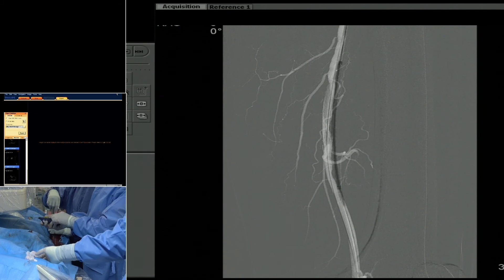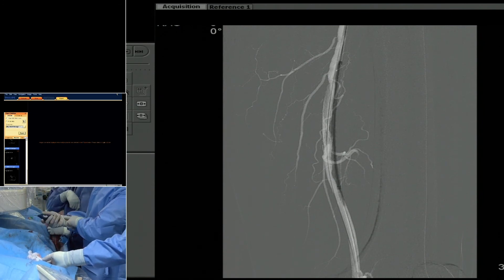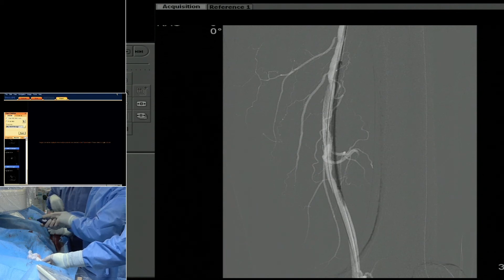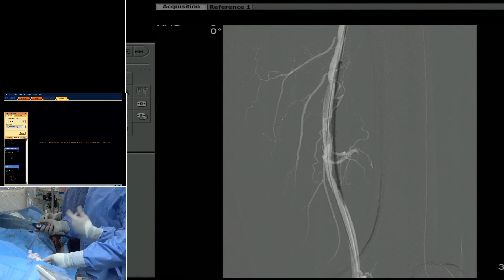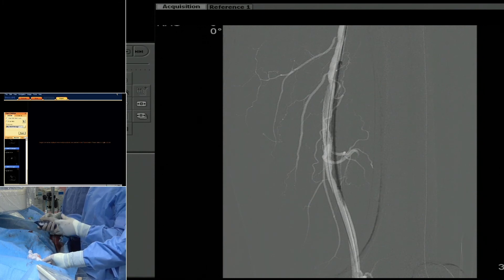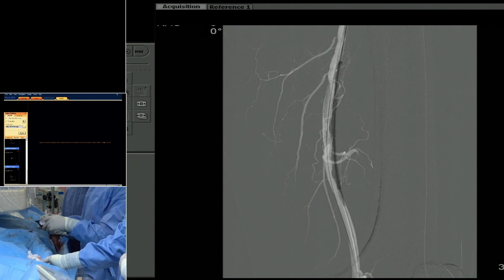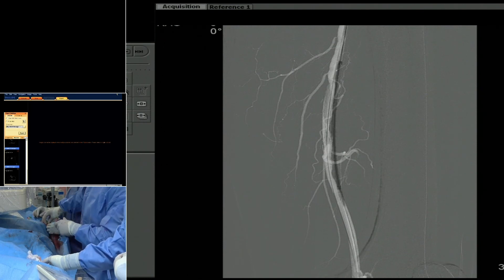This is basically a pinwheel-type deployment system. You press the pinwheel down aggressively and you'll hear a click — now it's ready to deploy. Usually you'll hear about 10 clicks before it actually starts to flower.